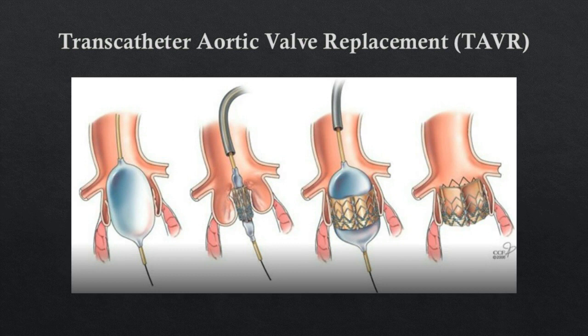The catheter is then removed, and the incision in the groin, neck, or chest, depending on the route chosen, is closed. Again, the recovery is relatively short, with most patients heading home same day or with a one-day stay. The TAVR procedure is currently the most common structural heart procedure in the world.